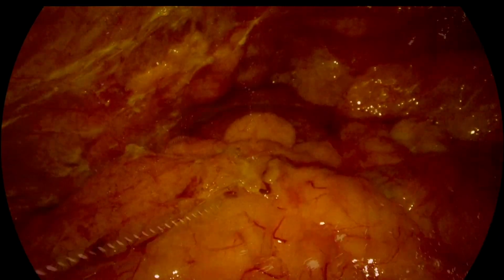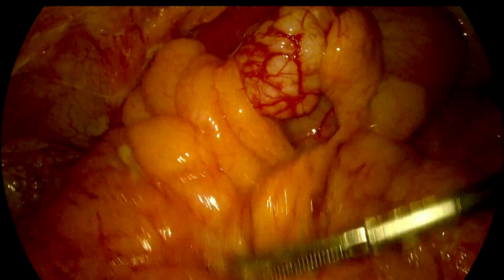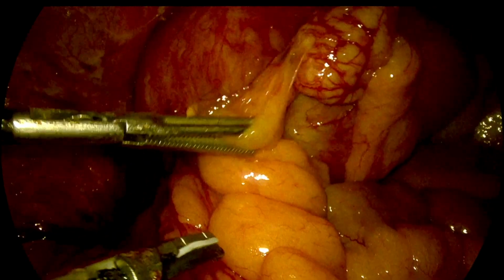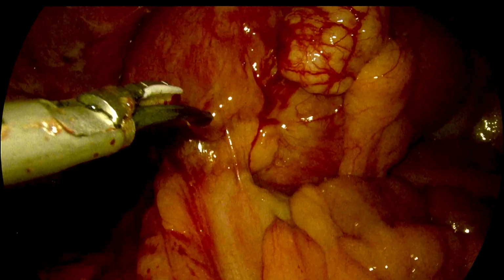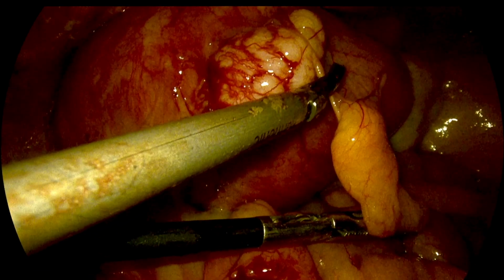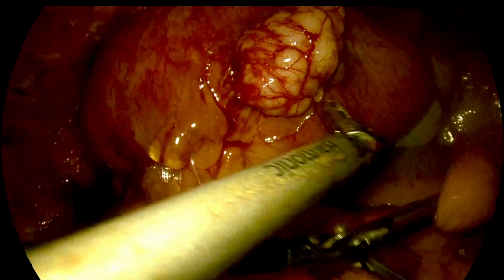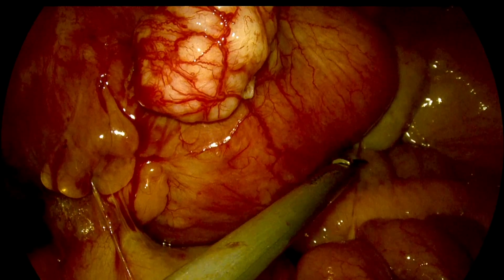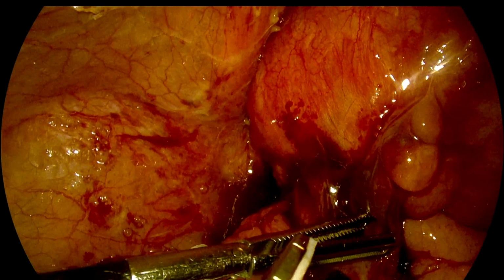Now we are going very close to the left lateral wall. Now we are able to see the sigmoid colon adhesions to the posterior surface of the uterus. We can see the taenia coli is adherent. Once we release the taenia coli, we can see that some amount of sigmoid colon is also adherent to the left posterior surface of the uterus. All these adhesions are better divided in the avascular plane. We should not try to pull and tear them, where a small amount of bleeding can lead to staining of this area.